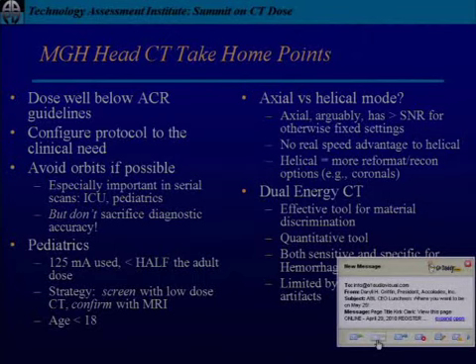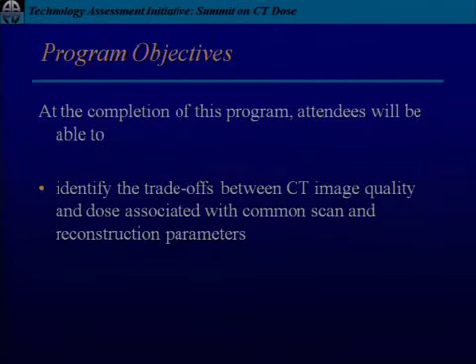Okay, dual energy CT is a new tool, and it's very good for material discrimination, especially when you're discriminating iodine from other dense objects. Okay, and it's a quantitative tool, and I see more applications of this coming up in perfusion CT, which is something we'll be talking about. So with that, I'll stop. If there are any questions, I'll take those questions.